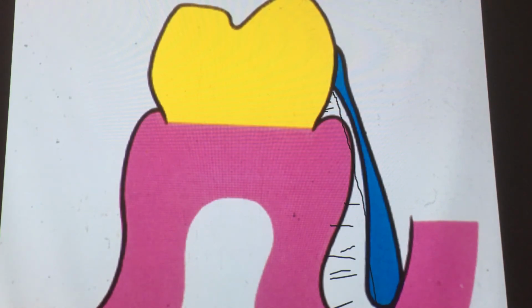So we're using our surveyor to either utilize the undercuts we want for our clasp and also block out the undesirable ones. So we've got desirable and undesirable undercuts. We choose which ones we want to utilize. Obviously, we're going to utilize 0.25 millimeters of the abutment teeth to retain the partial.